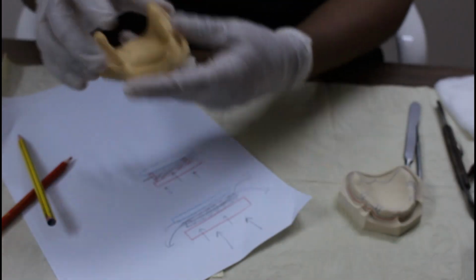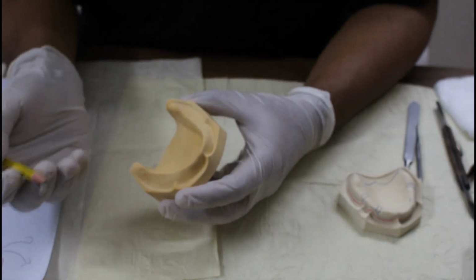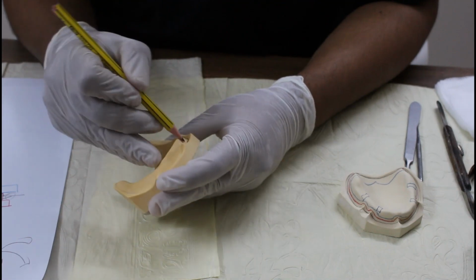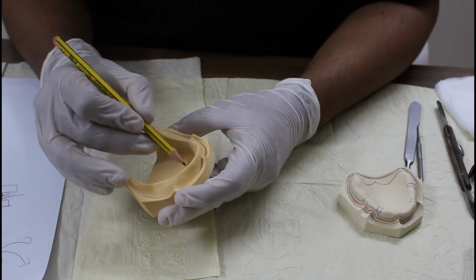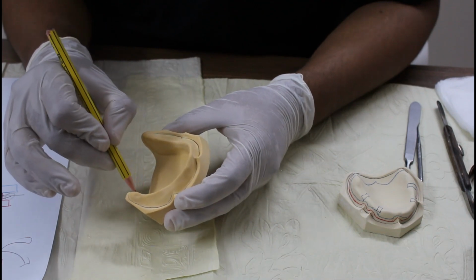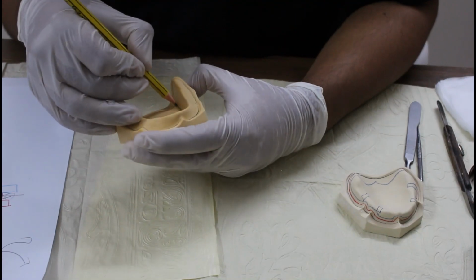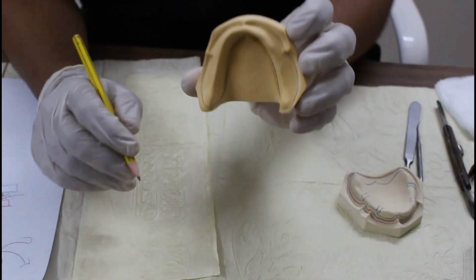Now let's make these lines for the mandibular also. So things are the same. Take your black color pencil, mark the sulcus line. The tray line will be your limiting areas. Okay.